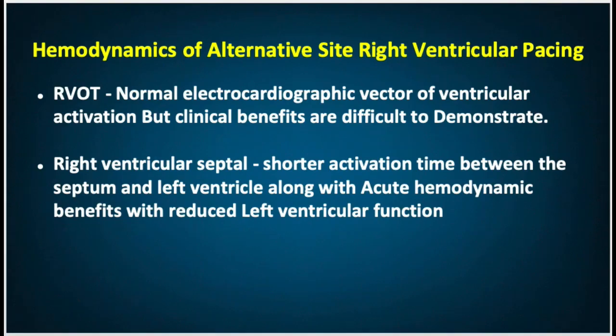These studies did not fully examine the role of patient selection for such factors as presence of atrial fibrillation, type and degree of heart failure, interventricular conduction delay, degree of mitral regurgitation, and diastolic dysfunction, which may influence the response to pacing.